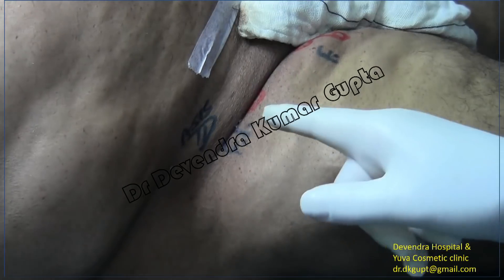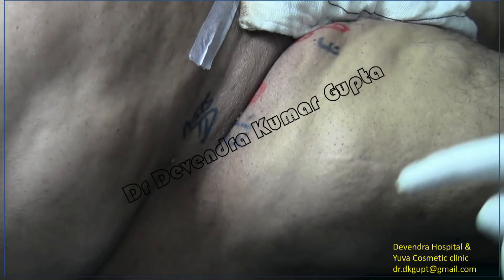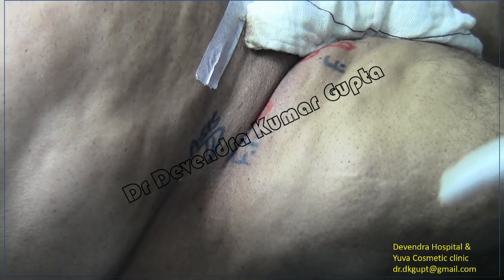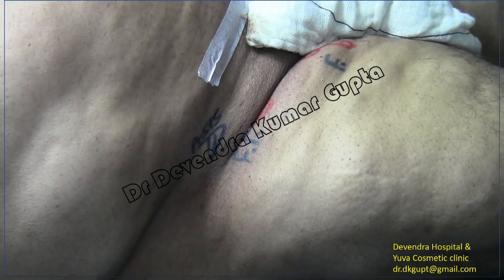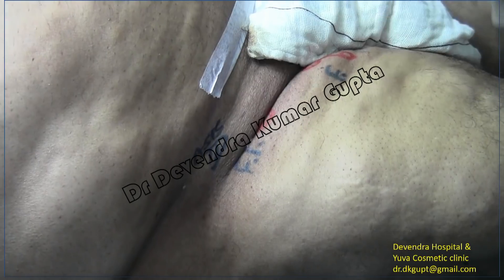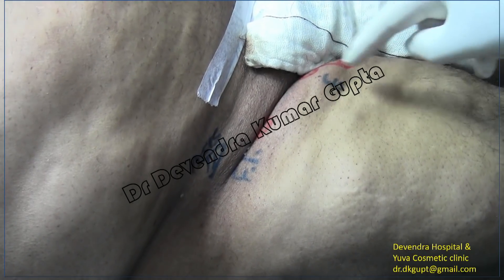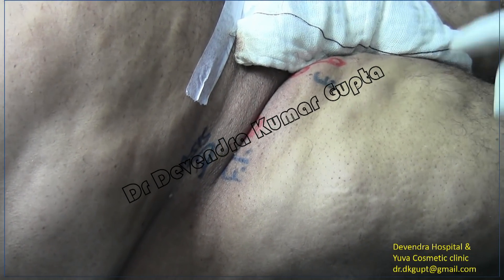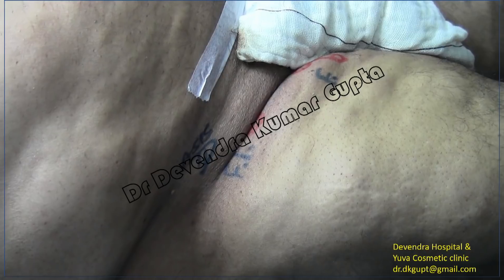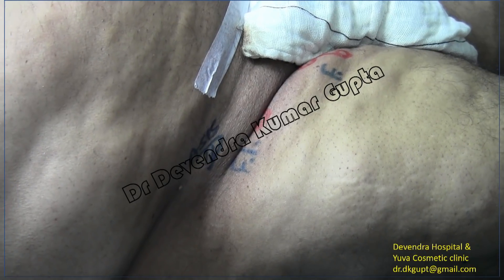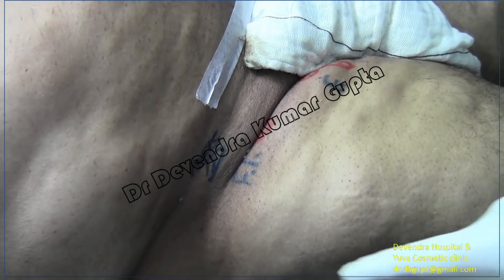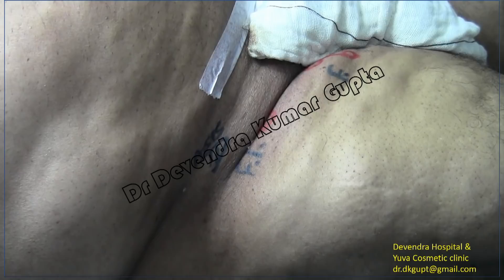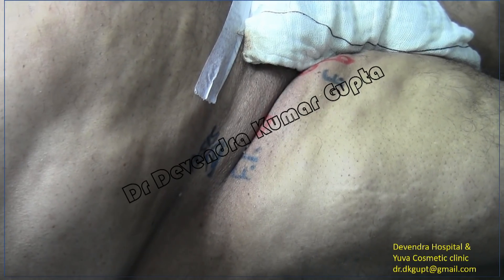This is the entry point for the fascia iliaca compartment block. In this case it is much easier to perform the fascia iliaca compartment block rather than a femoral block, because we have to pass through this fatty lump or lipoma to reach the femoral site. I will demonstrate how to perform the fascia iliaca compartment block in such a difficult case.